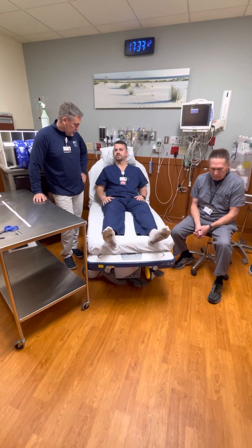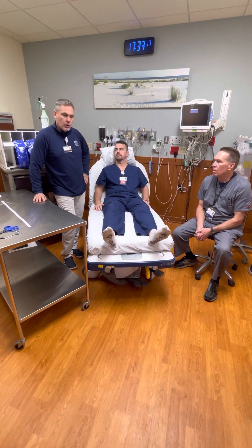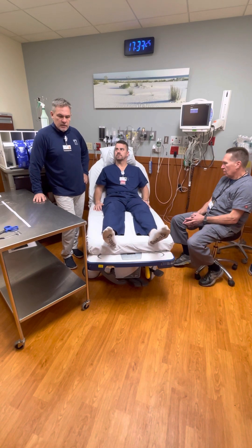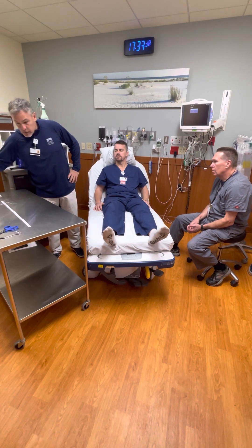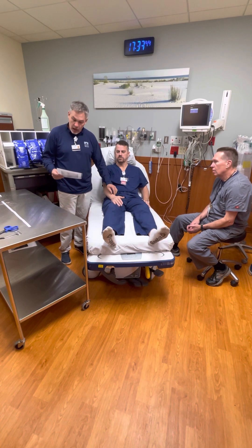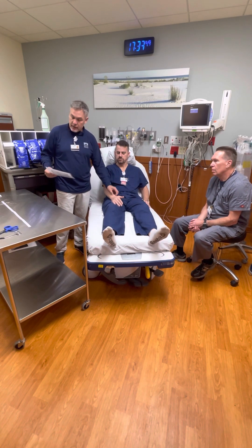We're going to do a wrist splint now called a volar splint - it's the most common splint we use in our department. We'll go over a couple of variations and discuss some of the pitfalls. With this patient, first I looked at the x-ray, found out exactly where the fracture was, talked to the provider, and I know his fracture is a non-displaced fracture of the distal radius.